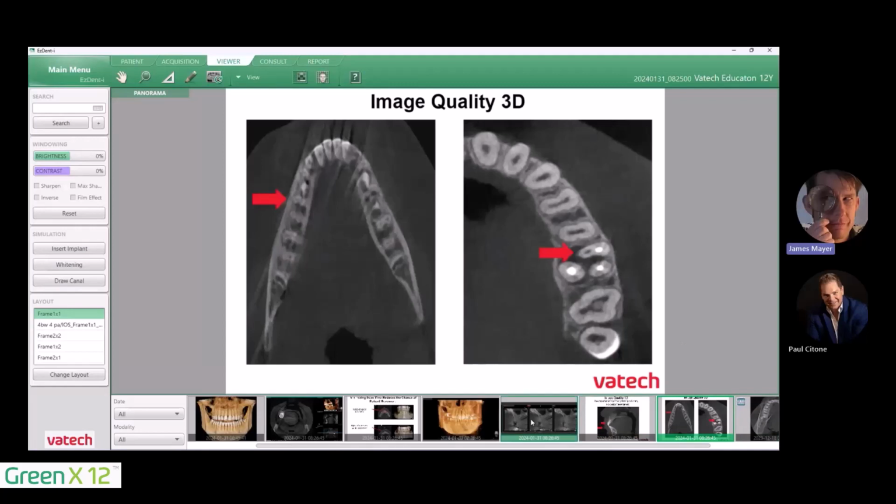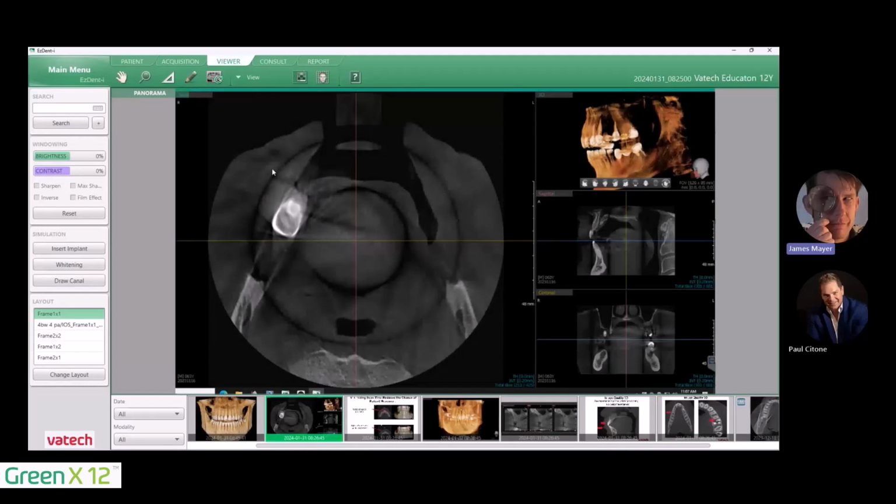Also wanted to touch on something else you may see in the cone beams, and this shouldn't be there. If you do see any circles within the data, you can see here we have 1 circle, 2 circles within the axial cut, and some long, dark vertical lines in the other. This is where the device needs a beam alignment or some internal adjustments. If by chance you do see that, that is something else that we would need to have our service team log in and adjust.